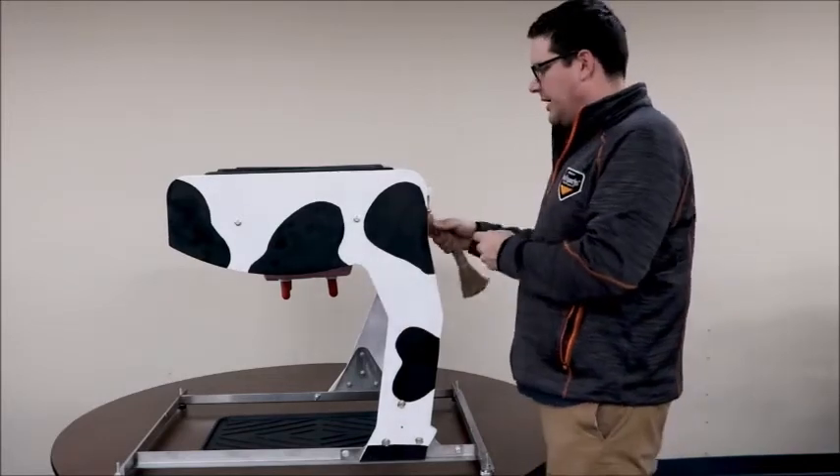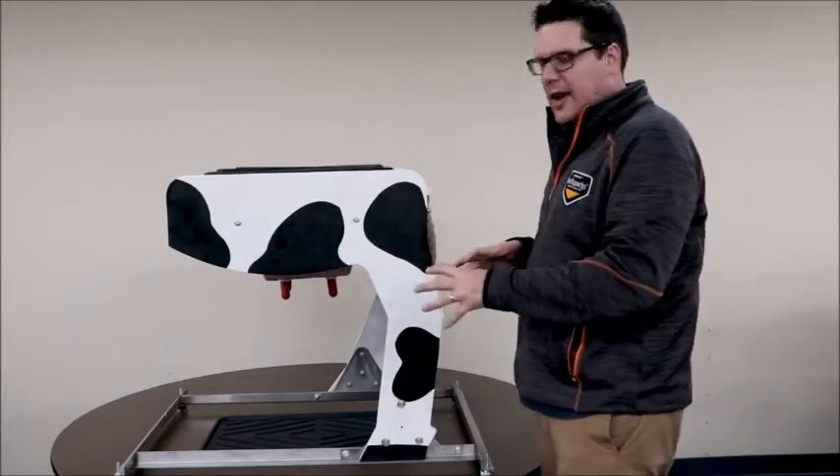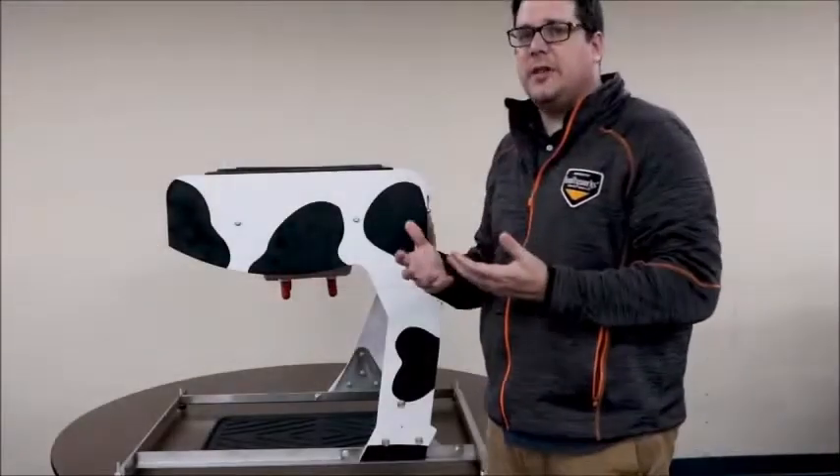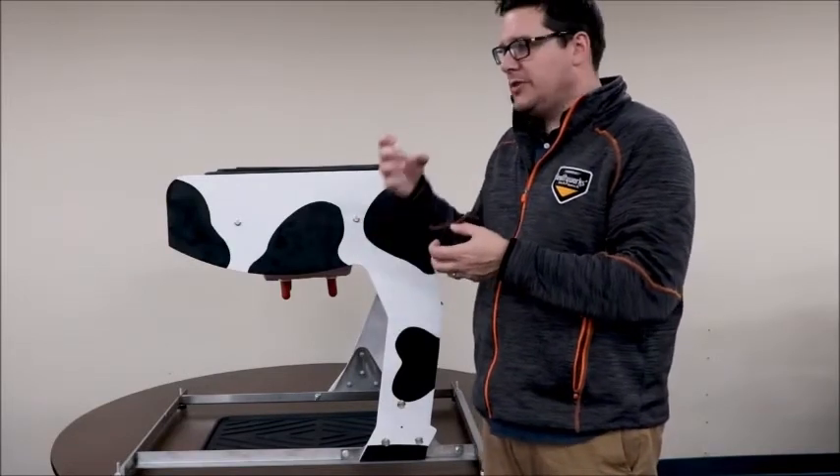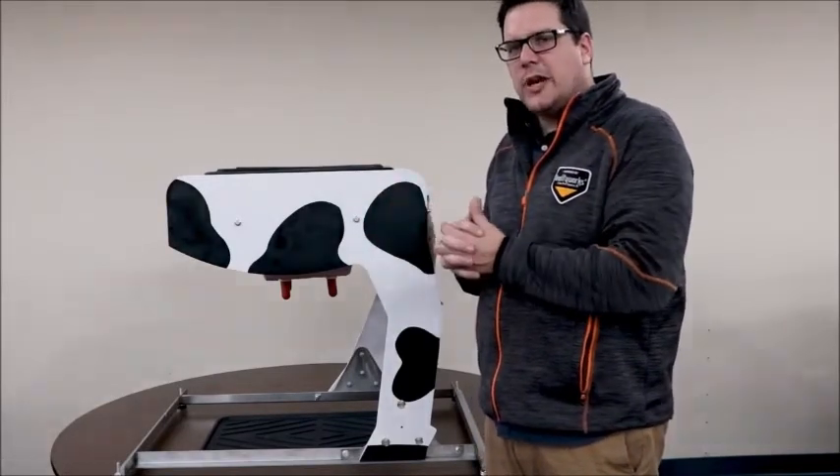It also has a tail, so you have to work around and be able to interact with that. Down here at the udder you can actually simulate different things — putting on the milking machine, doing teat dip, and showing students how to do that. We can open the top hatch here.